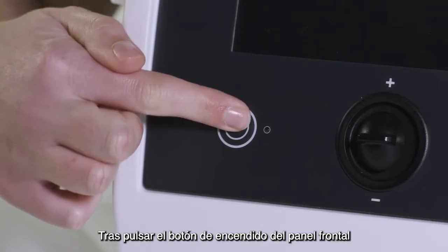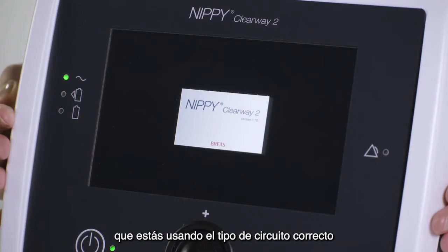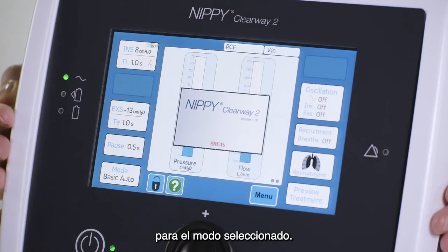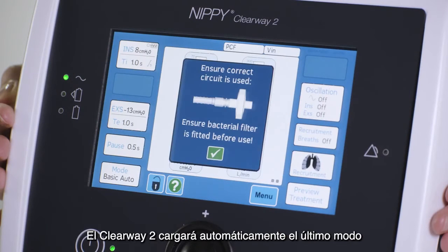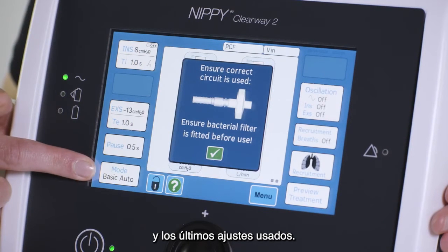After pressing the power button on the front panel of the Clearway device, you will be asked to confirm that you are using the correct circuit type for the mode currently selected. The Clearway 2 will automatically load the last mode and settings that were used.